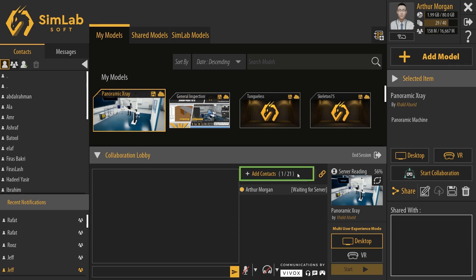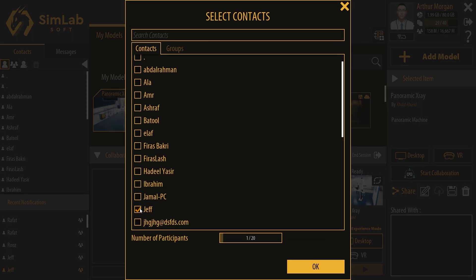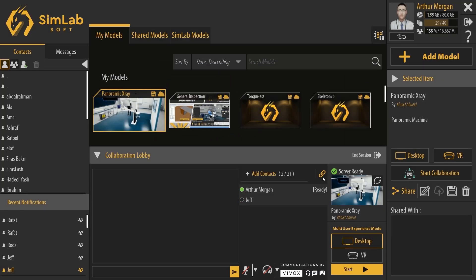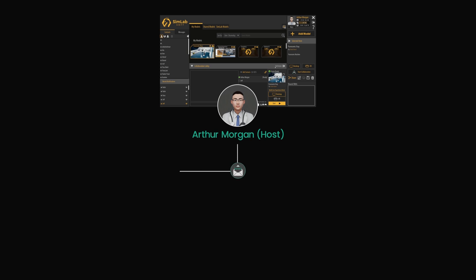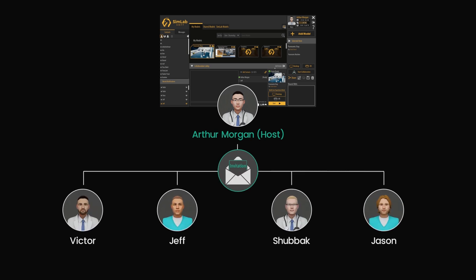Once I'm in the collaboration lobby, I'm going to click on Add Contacts, then select Jeff to invite him to the collaboration session since I already have him as a contact. Then I'm going to click on the link invitation icon to generate a link that would allow any user to join the VR Collaboration session. I will then copy the link and distribute it to the other trainees through Discord. Of course, you can use any messaging system — it doesn't have to be Discord, but this is what I usually use to communicate with the trainees.